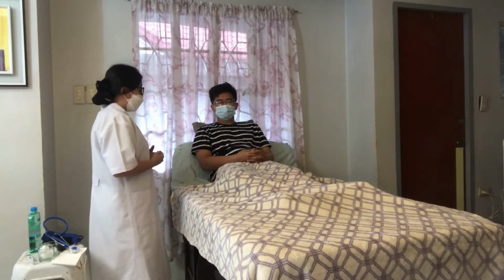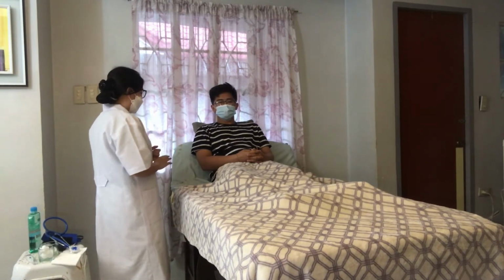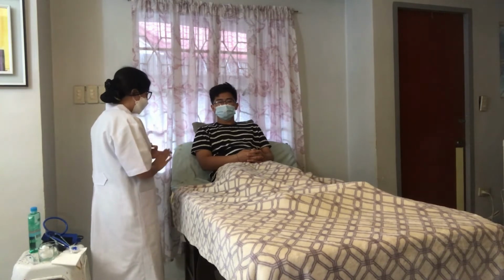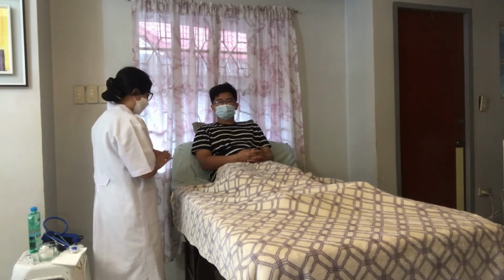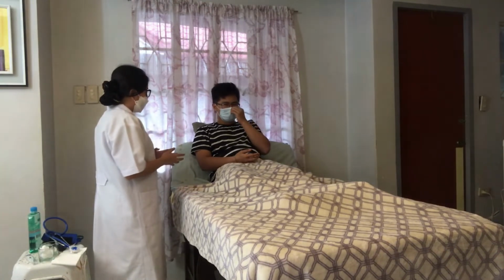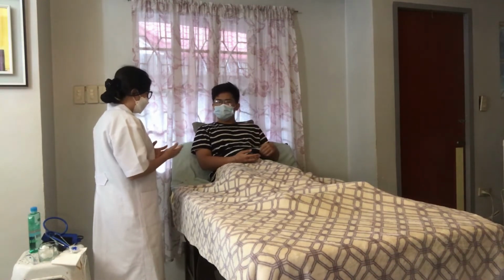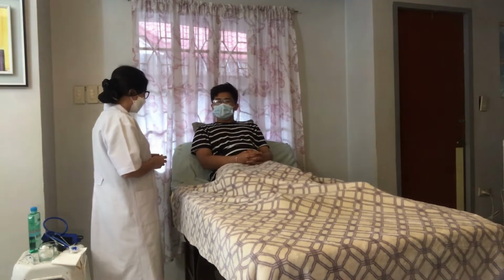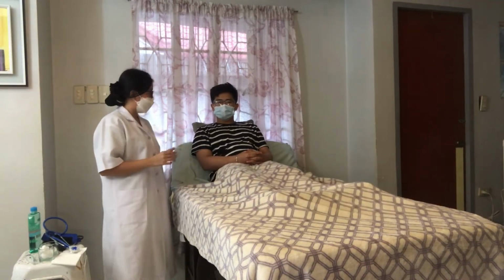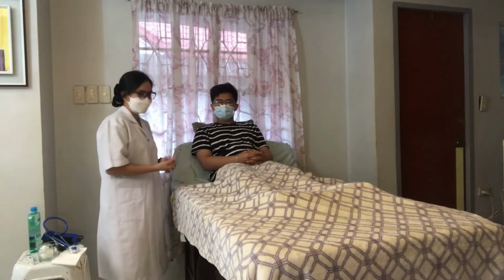So today, sir, I will be taking your vital signs, and vital signs include your body temperature, your pulse rate, your respiratory rate, and then your blood pressure. So before that, sir, may I know what are the activities that you have done earlier and were you involved or engaged in strenuous activities? Just sleeping. Alright, sir, that's good to know. So now we are going to proceed to taking your body temperature.